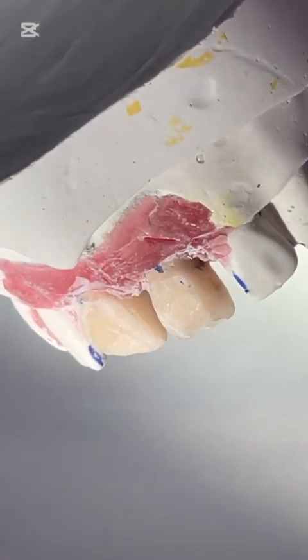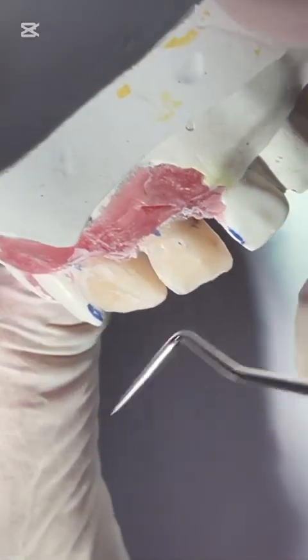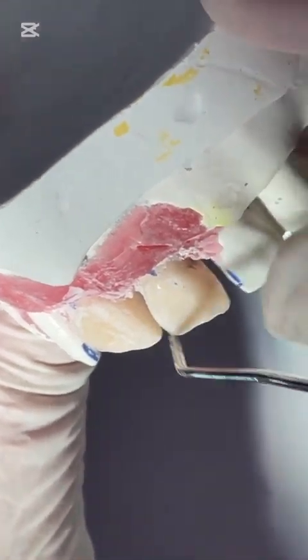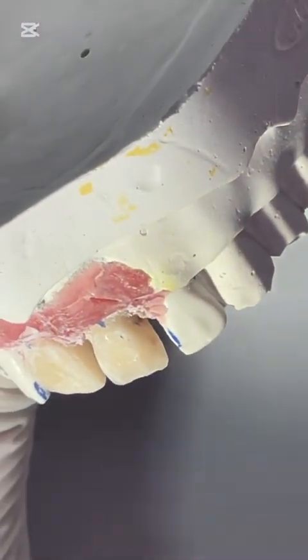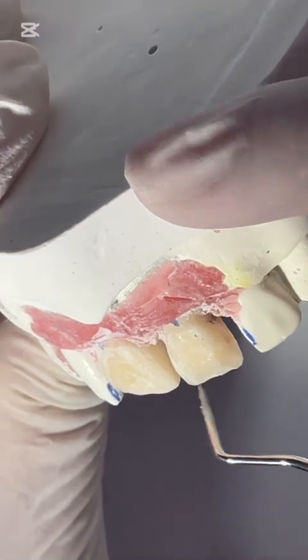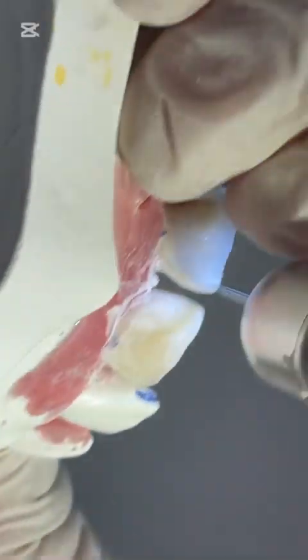Now I removed all the previous composite, the mock-up composite, and I did beveling to the surfaces that I will add composite to. I will add here, here, here, and here to the incisal, okay? Guys, look now. You have a sharp edge here. And we said, like in dentistry, we don't like sharp edges. So what will I do? Rounding.